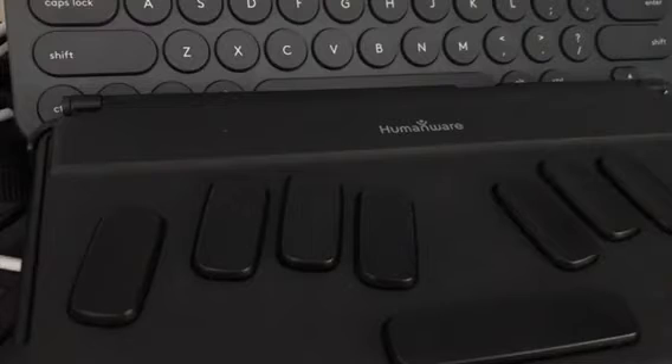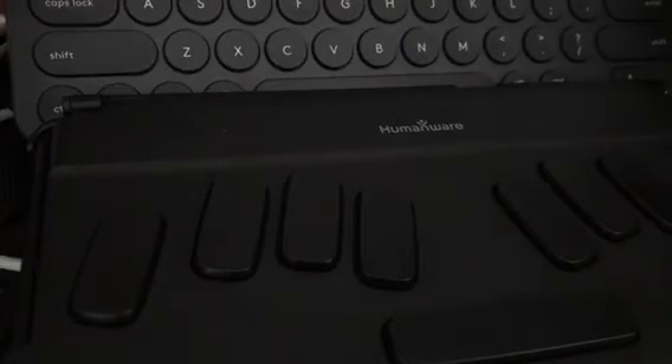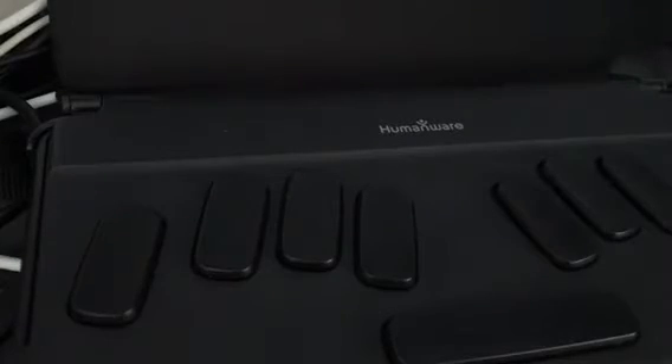Now I'm going to get my keyboard that I want to pair. Here it is - this is a Logitech multi-device keyboard. I believe it's the Logitech K380. It supports up to three devices and fortunately it will support the BrailleNote Touch.